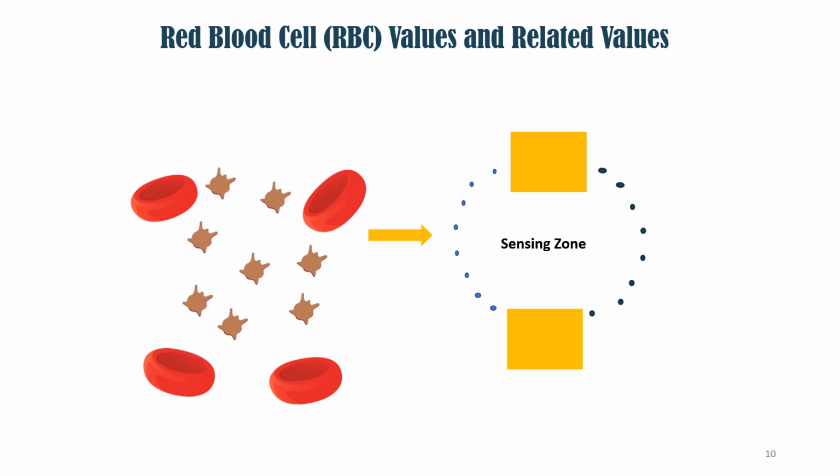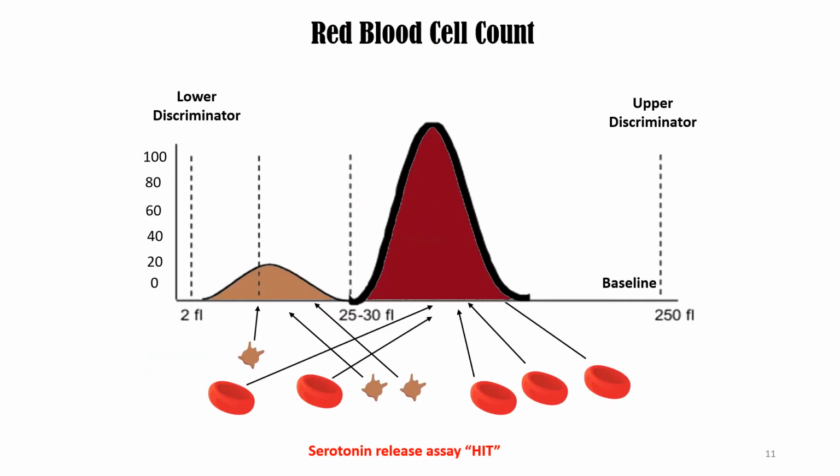Now you see, that's how problems happen. That's how errors occur. Because the machine cannot really read specifically: is this a red blood cell? Are those white blood cells? Is this little thing a platelet? No, they only look into their size.